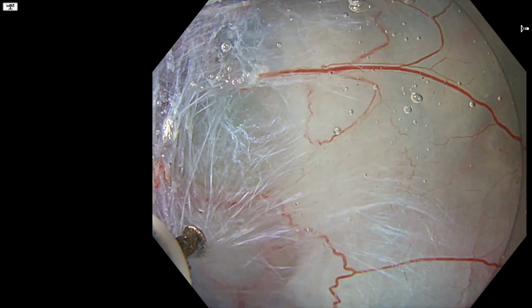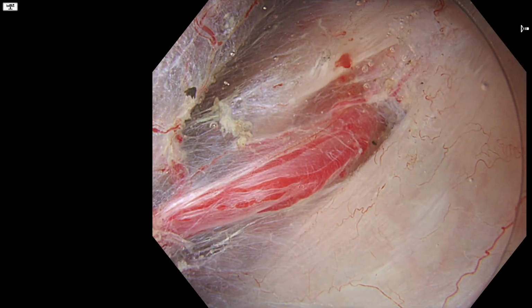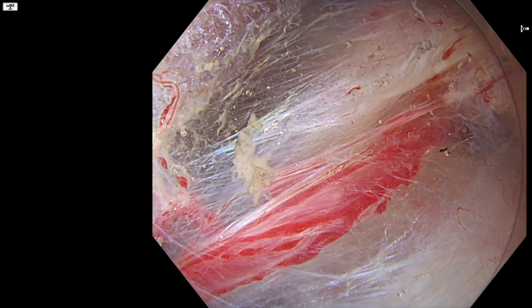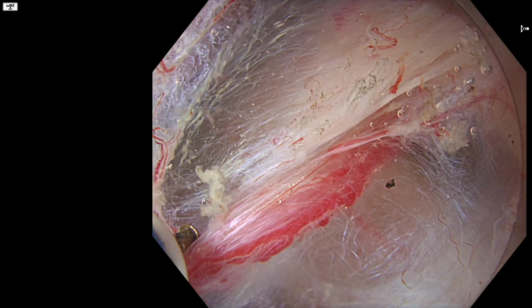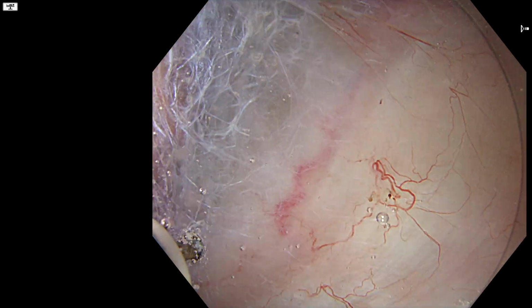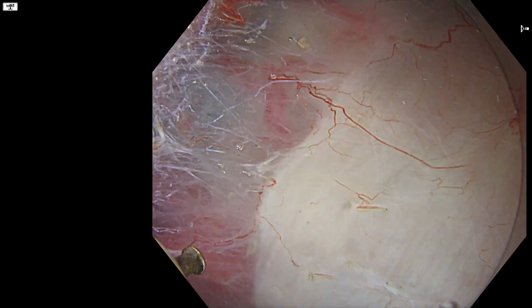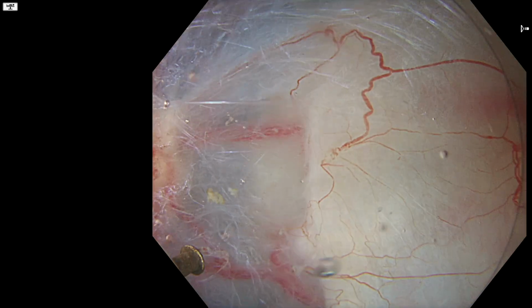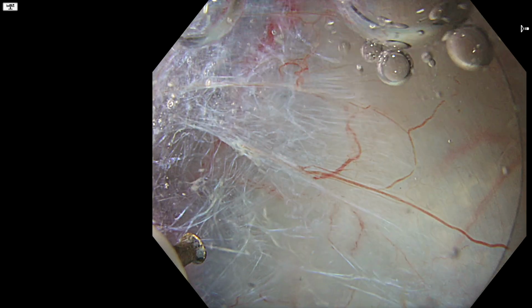So there's another visible big vessel trunk or group there. So that's 3 in a small confined space. So I'm already telling the nurse to open the coag grasper, because I usually try not to use it unless it's strictly necessary. But in a lesion this size with this many vessels, and in particular with a new knife that I'm not familiar with and I'm not sure how well it's going to perform pre-coagulating vessels, I think it's pointless waiting. You might as well open it at the very beginning and start sealing the high-risk vessels.